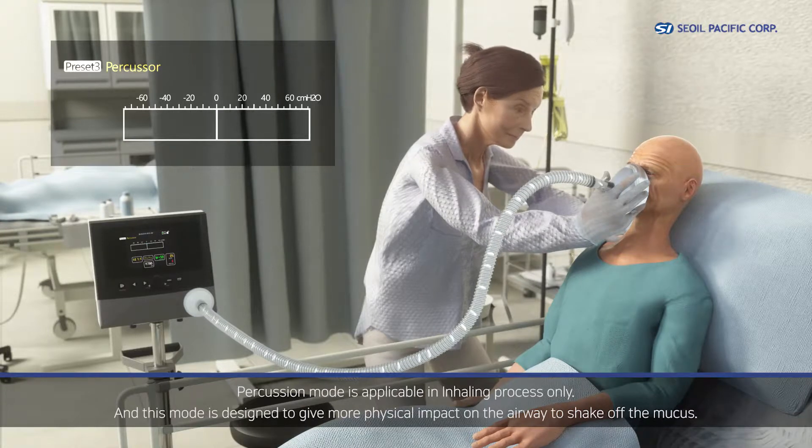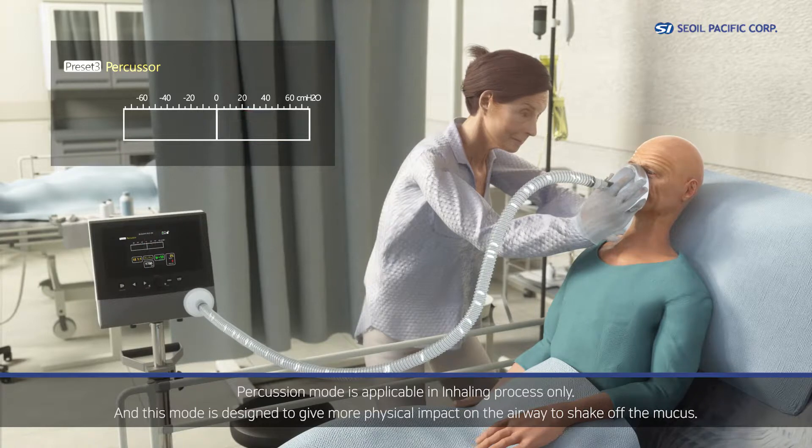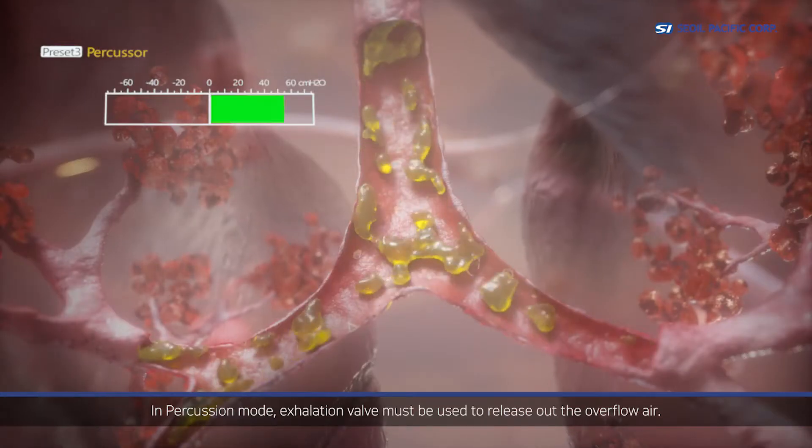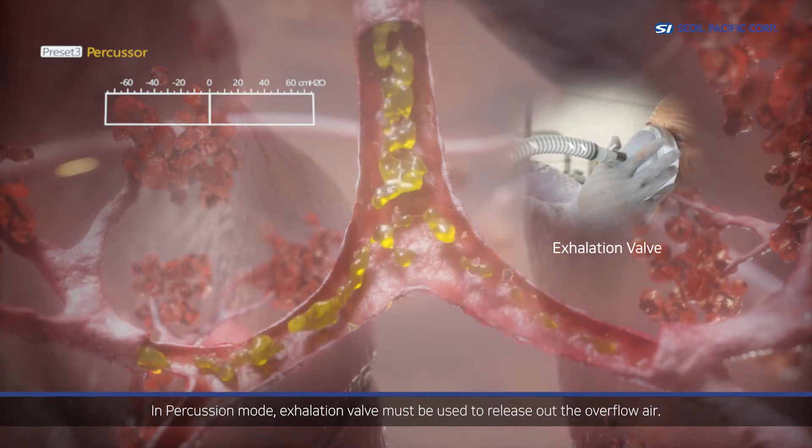Percussion mode is applicable in the inhaling process only, and is designed to give more physical impact on the airway to shake off the mucus. In percussion mode, the exhalation valve must be used to release the overflow air.